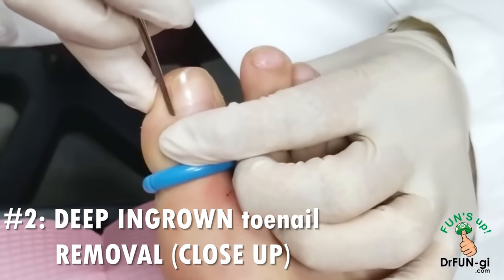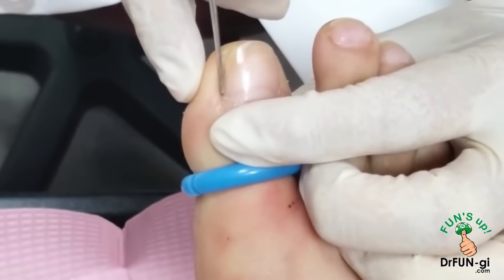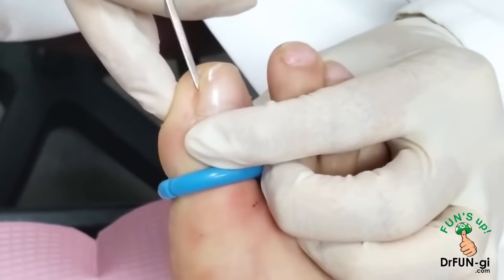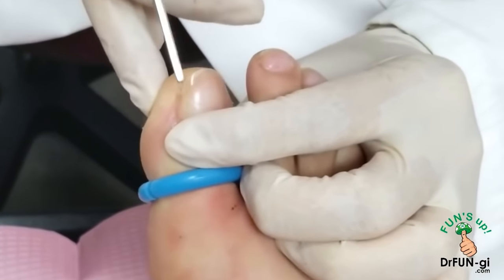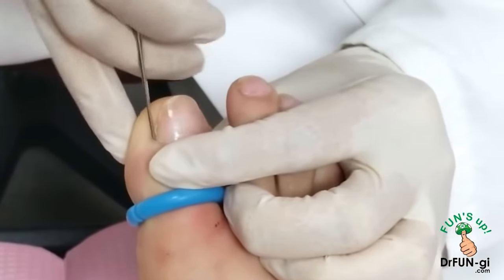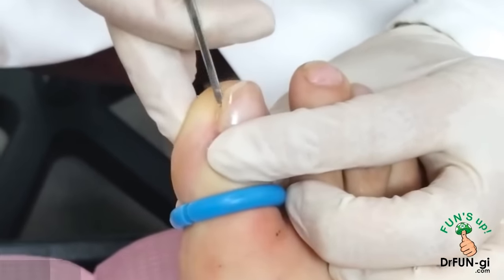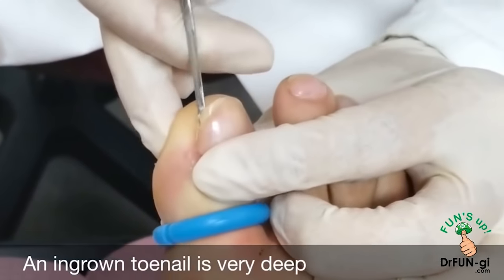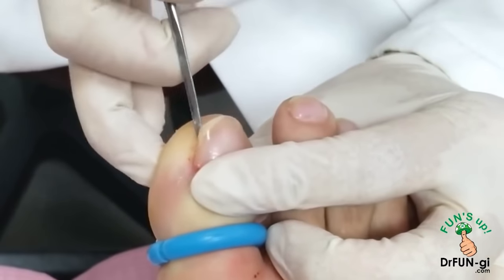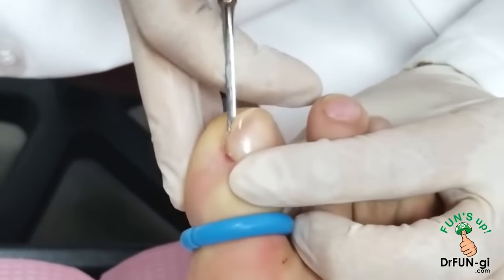I'm freeing up the nail on the top a little bit to make it look nice — up to here where it kind of bends down. That's how far we need to go without taking too much, which would make the nail look not so pretty. There's a lot of callus underneath it, so it's kind of hard to free up; I have to do it very carefully and methodically so I'm not hurting the nail bed. It's really deep on this corner.